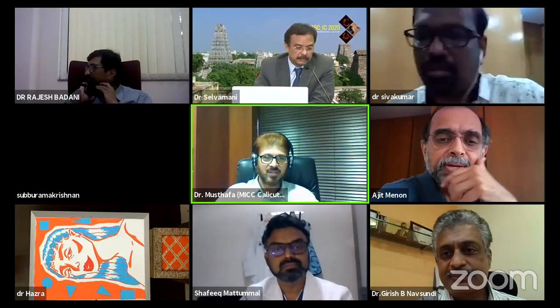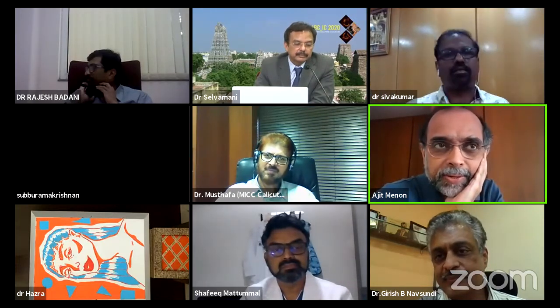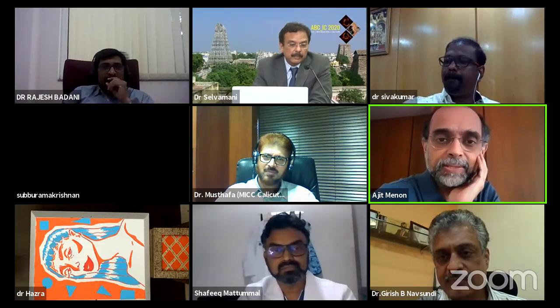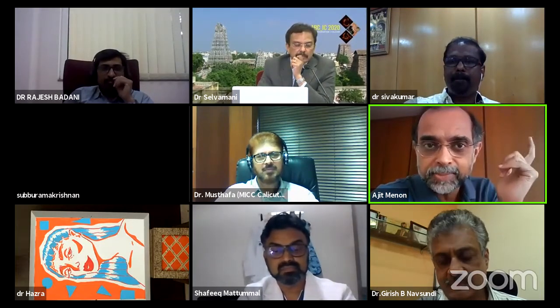Any other comments? Yeah, Dr. Ajit Menon. Yeah, hi. Can I please comment? Sure. See, normally when you're talking about Tuohy-Borst related issues in withdrawing the balloon catheter, or even with suction catheters, you tend to introduce air. Air embolism is far more common.